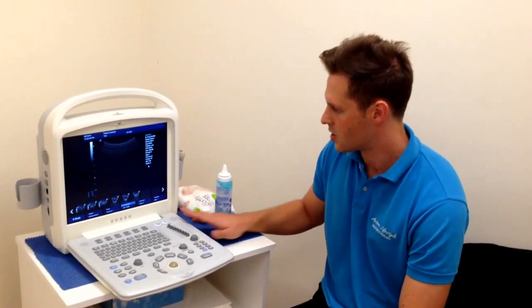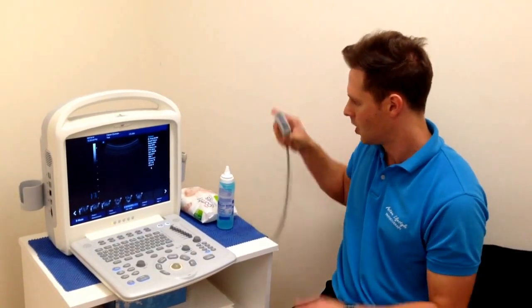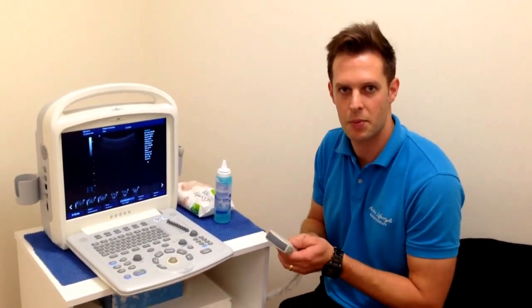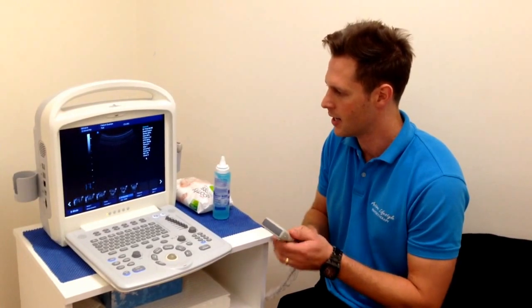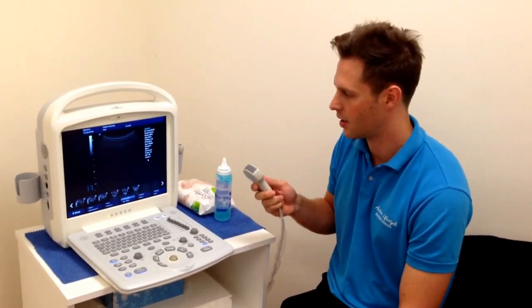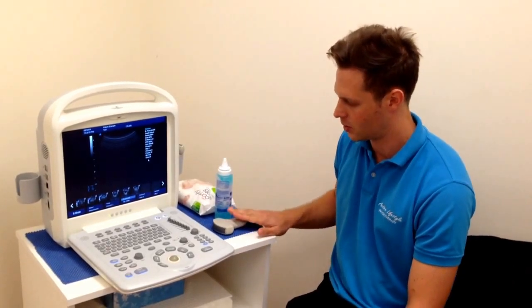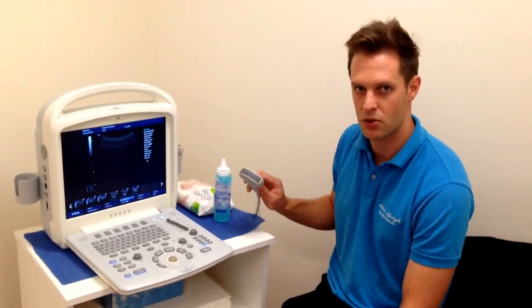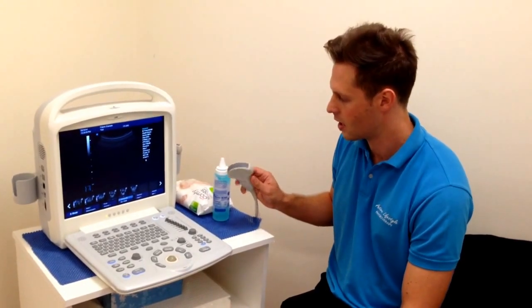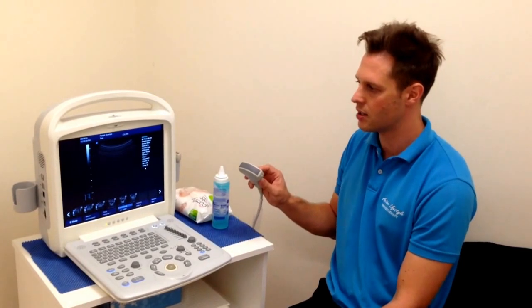This particular machine has two probes. We have a convex probe, which we tend to use for the abdomen, core muscles, and some of the deeper musculoskeletal structures like the hip, for example. This one has a lower frequency, so it tends to be between 2 and 5 megahertz.